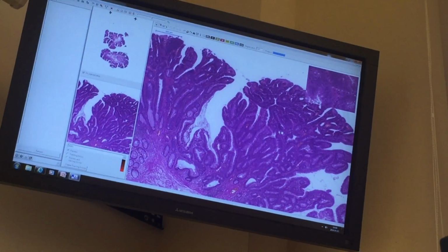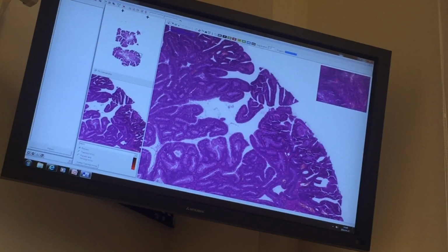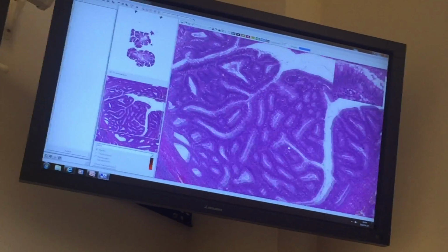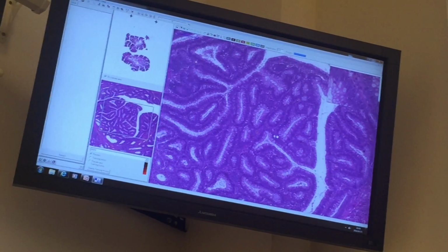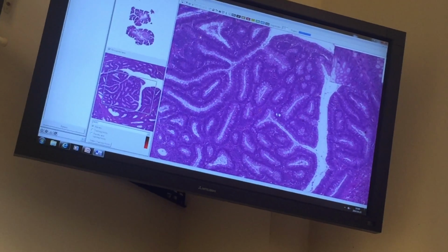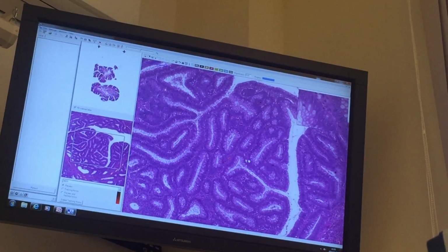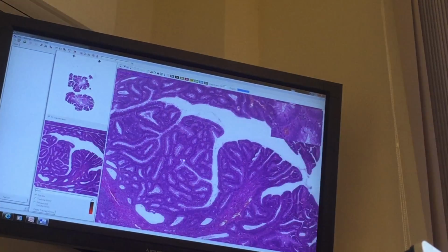Okay, it looks like a leaf of a palm tree, even this one. It's full of lamina propria. But the deeper parts here, for example, this is the tubular structure. You can imagine tubes, when they depress, and the inner part will be lined by the mucosa. The villus is like a papilla, the center there is a core and the outer part is covered with the epithelium. I usually imagine it like this.